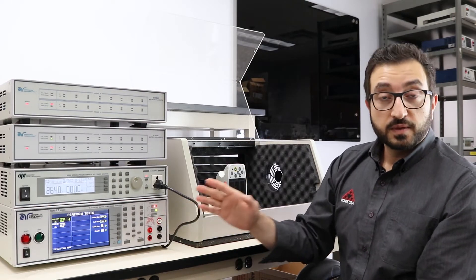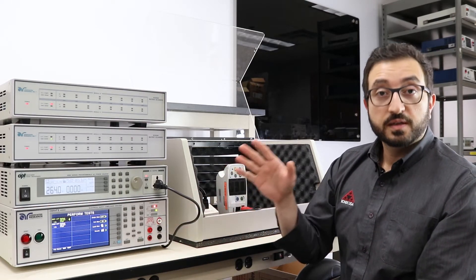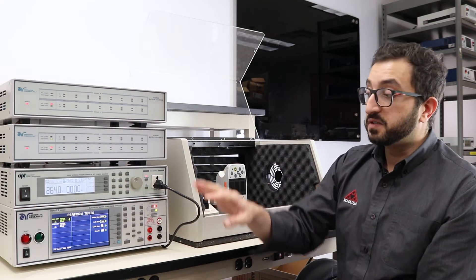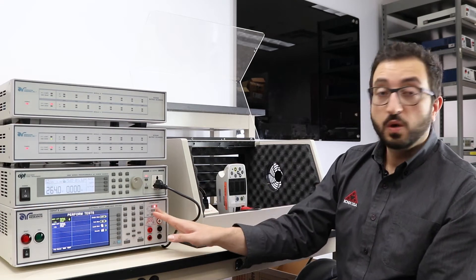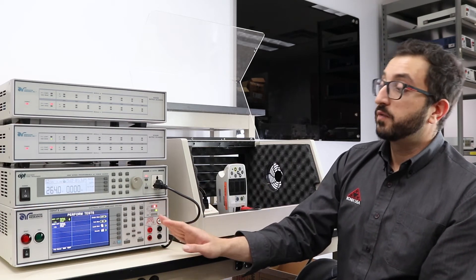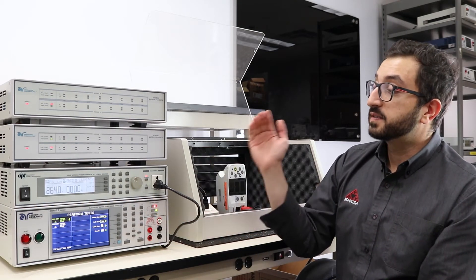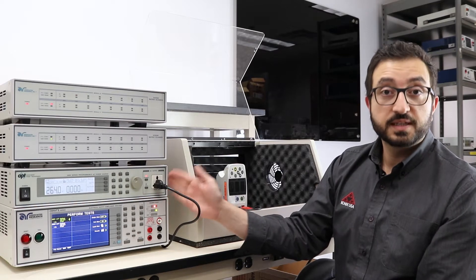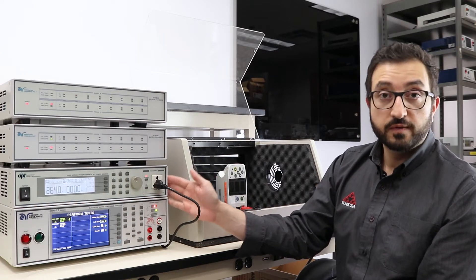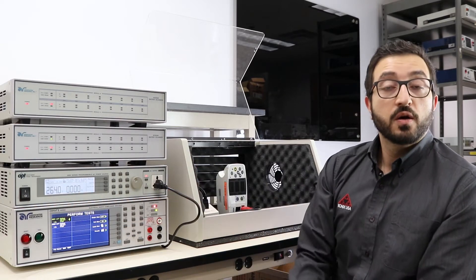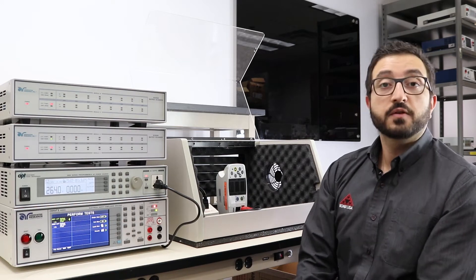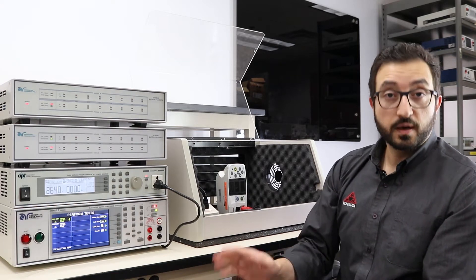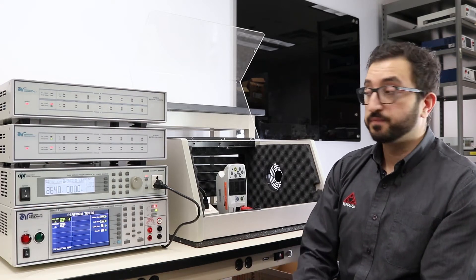T1 that was labeled on the diagram we saw earlier is built into our leakage current tester, and we're using a secondary source to represent T2, which will be used to apply 264 volts—that's 110 percent of line voltage—to our applied part.